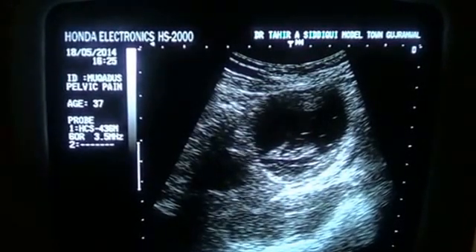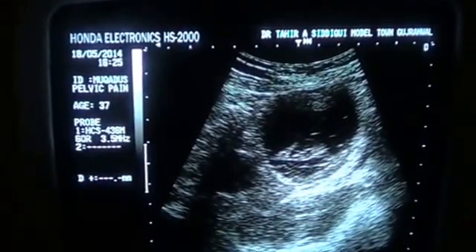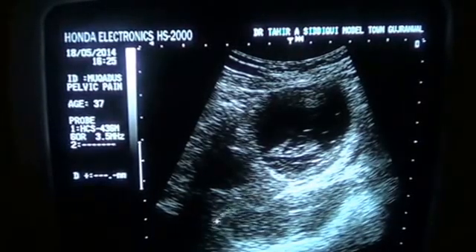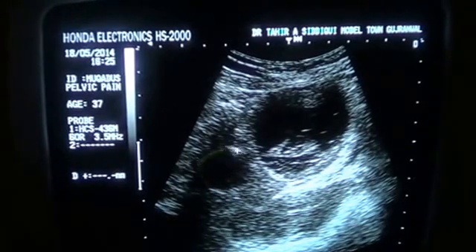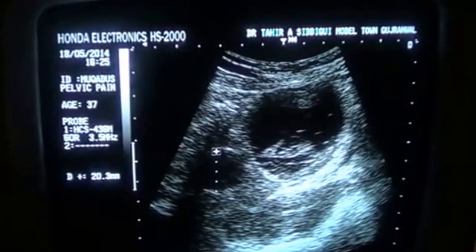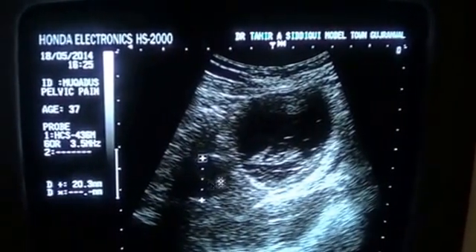The interesting thing, we can only visualize that this is the vagina, this is the cervix, this is the cervical canal. Now this area is the cervix. This is the lower segment of the uterine cavity, uterus lower, and now this is the endometrial canal. Now from here we see a cystic area measuring approximately 20 by 20 millimeters with another cystic area at the fundal region.